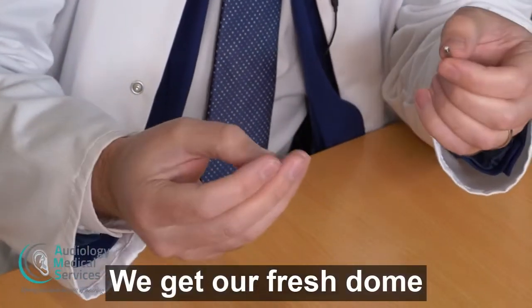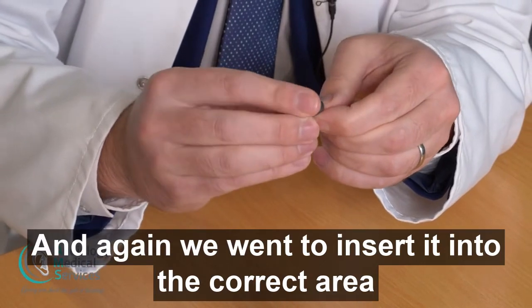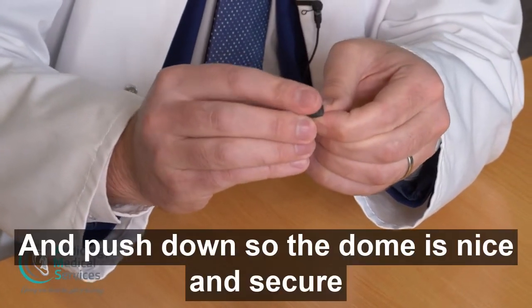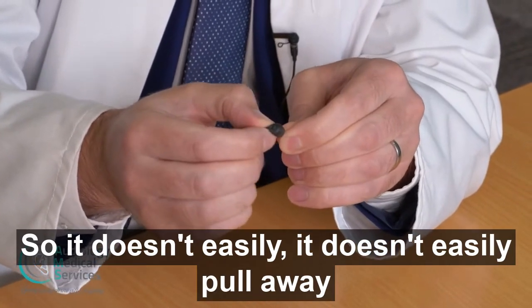We get our fresh dome and again we want to insert it into the correct area and push down so the dome is nice and secure so it doesn't easily pull away.